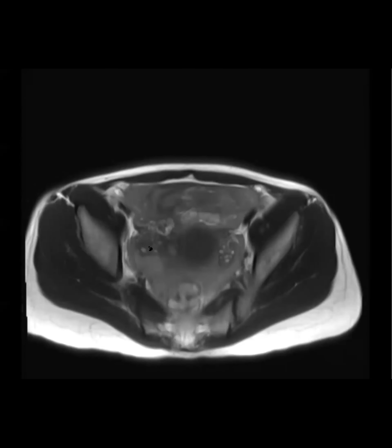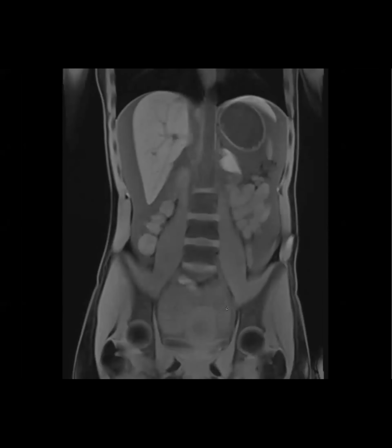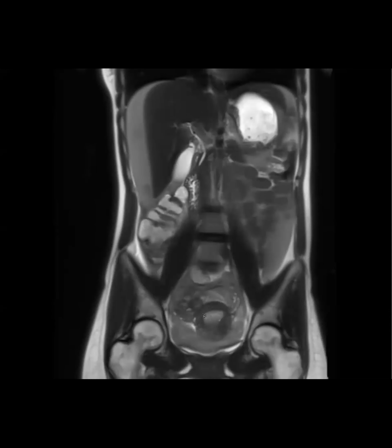This is one ovary. This is the other ovary. And there was this complex structure here in the right adnexa. So we couldn't say this looked like a gestational sac, but we did say there was a complex mass looking thing in the right adnexa, and there's massive hemoperitoneum. And so basically this is a ruptured ectopic until proven otherwise. And I'll show you that structure again here. So this is the ovary on one side, on the other side, and then this was the structure in the right adnexa. The patient went to the OR, and this was a ruptured tubal ectopic with massive hemoperitoneum.